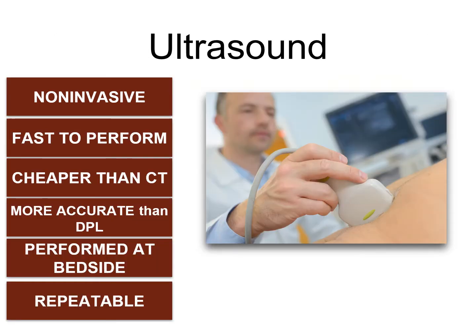And so in the 90s, this is where point-of-care ultrasound suddenly bursts on the scene. And ultrasound as a technology had existed, obviously, for years. We had been using it in OBGYN for years. And the advantages of ultrasound, obviously, it is also non-invasive, no additional holes. It is a quick test, much faster than a DPL. It's cheaper than a CT. It's also more accurate than a DPL. No chance of false positives from the extra hole that you're making.